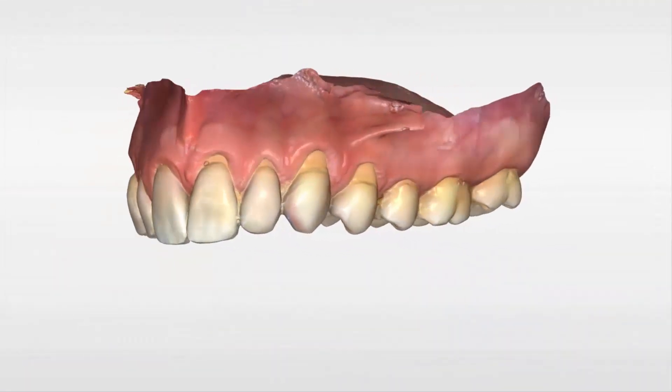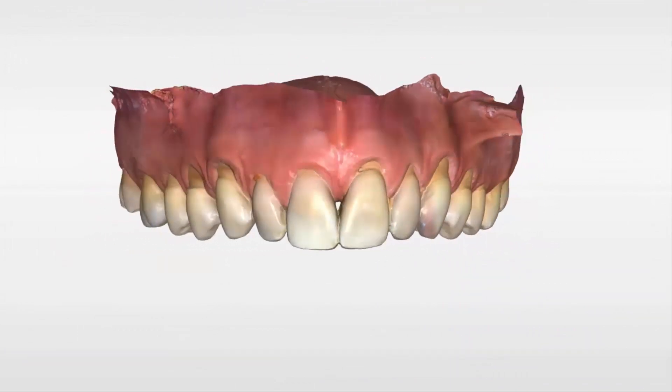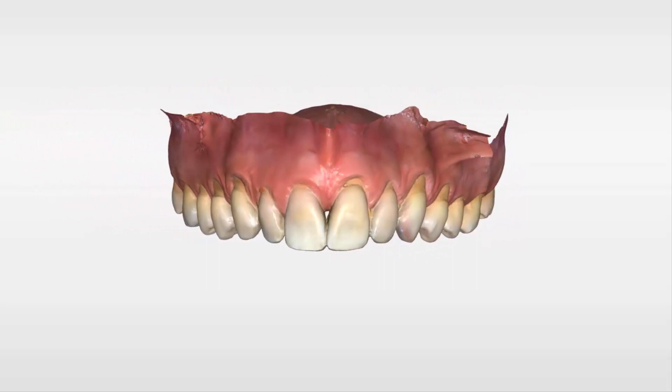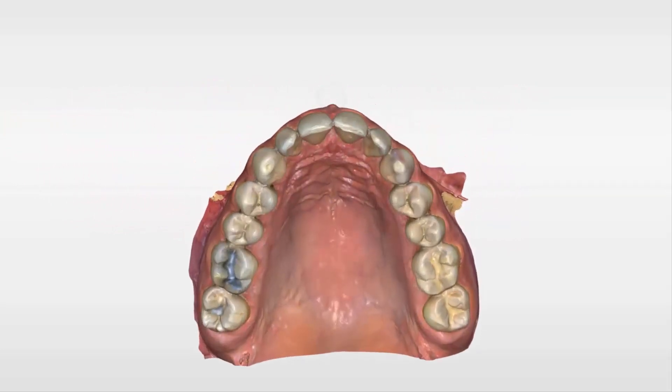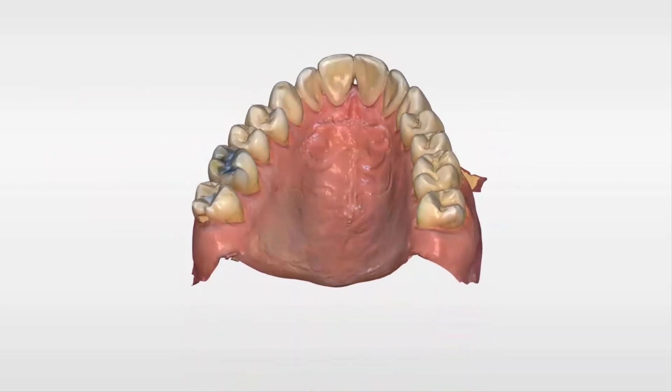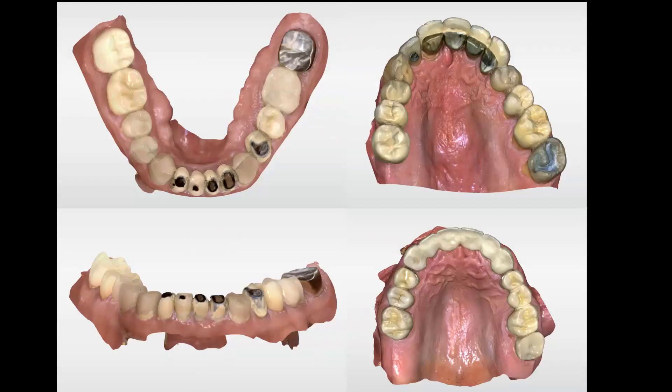The PrimeScan's accuracy and scanning technology allow you to scan full arches extremely fast and smooth. Its large field of view captures almost all details within the initial scan sweeps, and hardly any effort is needed to fill in the data. Most incredibly, the PrimeScan scans restorations including all metal, zirconia, and lithium disilicate exactly the same as teeth — no additional effort or scanning strategy is needed whatsoever.